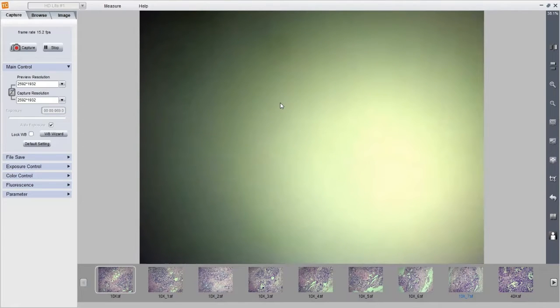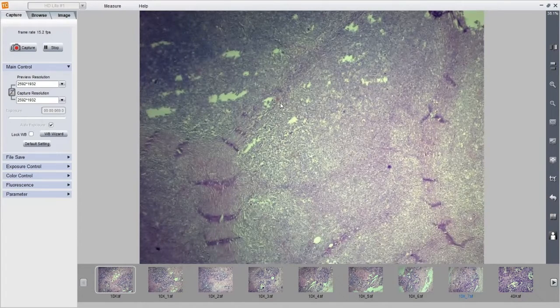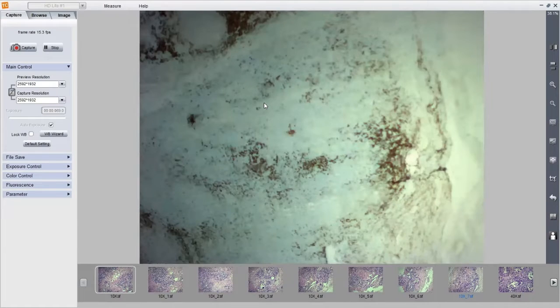One thing I wanted to tell you is that whenever we diagnose Hodgkin lymphoma in low power, in an H&E section, the Hodgkin cell should be staring at you. It should not be a situation where we are hunting for the Hodgkin cells. My guide, Dr. Gujral, when I was doing my DM in Tata, would say that if you are hunting for the Hodgkin cells, most probably it is not Hodgkin lymphoma. In low power, the Hodgkin cell should actually stare back at you, and it should be very easy to diagnose. Whenever we are desperately trying to find the Hodgkin cells, it is unlikely to be a Hodgkin lymphoma. Now this is the CD20.